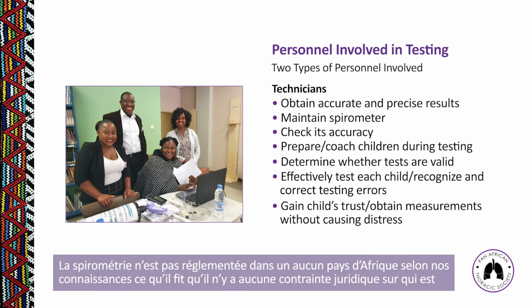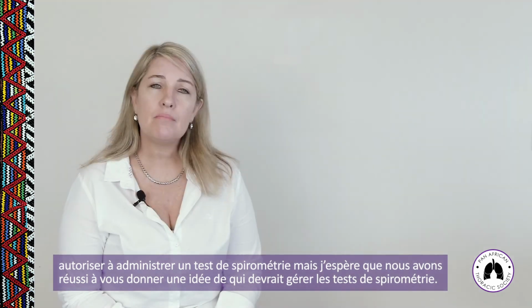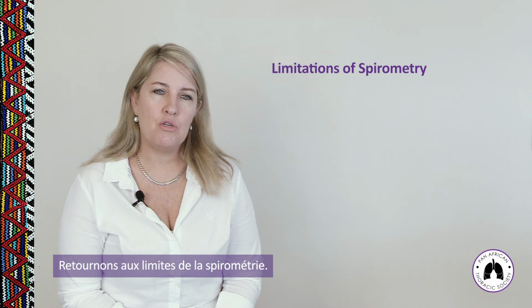So spirometry is not legislated, as far as we're aware, in any country in Africa. So there's no legal restrictions on who can perform spirometry testing. But I hope that we've been able to put the personnel into context for you for testing in your own workplace. Back to the limitations of spirometry.